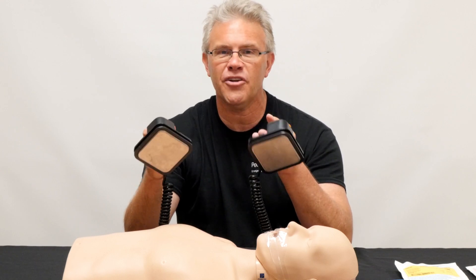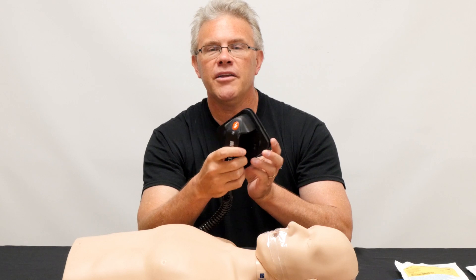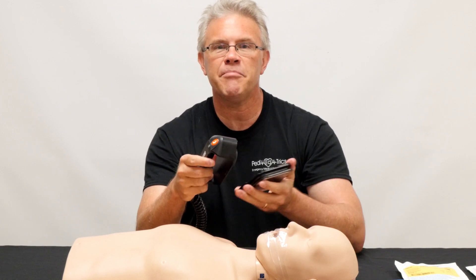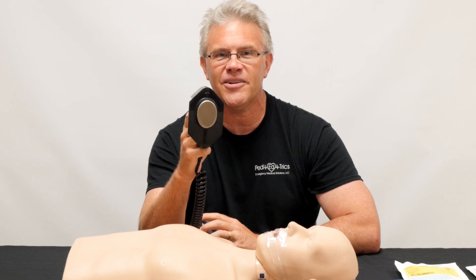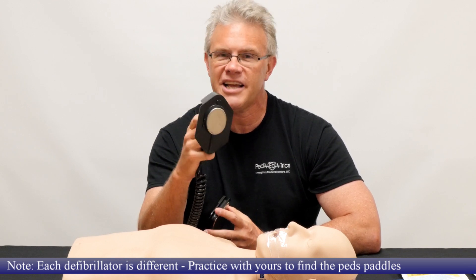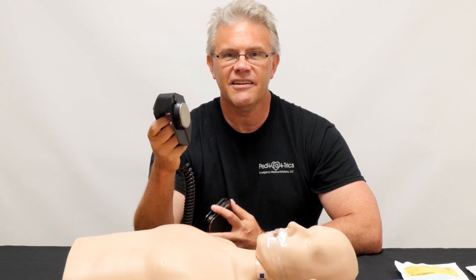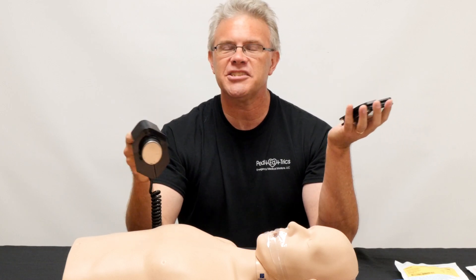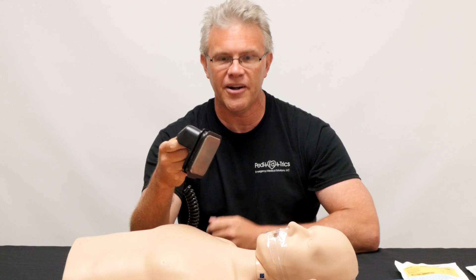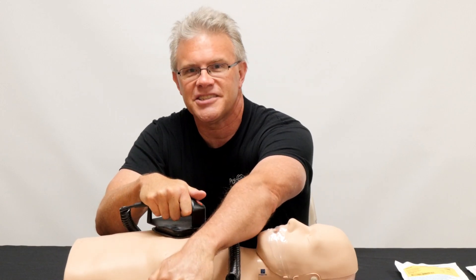If all you've got is the adult ones, absolutely feel free to use them — no worries whatsoever. But check this out: if you take your adult paddles and simply slip off the cover, right there on that very same paddle is your pediatric or infant size. So if the child is under one year old, about 10 kilos or 20 pounds — pretty much if they look like a baby — you can use these little tiny defibrillator paddles. For everybody else, just take the paddles as they sit on your defibrillator, read where to put them, place them on the appropriate spot on the chest, and do what you need to do.